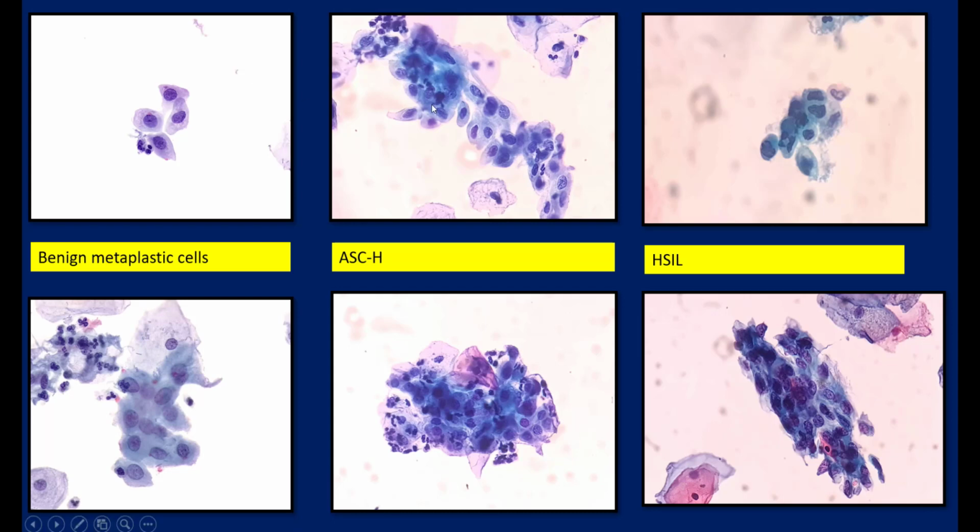I'll call it ASC-H. And once again, we have another group of cells over here in which we have got some degree of nuclear membrane irregularities, okay, some abnormal chromatin, not enough to call it high-grade cell. However, when it comes to high-grade cells, this is pretty clear-cut, extremely hyperchromatic nuclei over here, marked irregularities of nuclear membrane. This is somewhere I'd feel confident to call it HSIL, and this you have already seen, the syncytial aggregate of cells, okay, which I have already described in one of the previous slides.